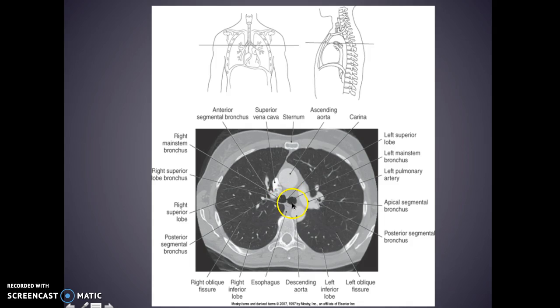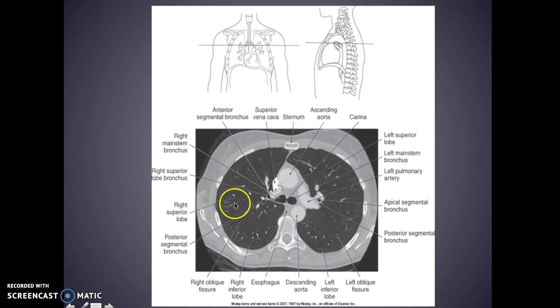This is your left pulmonary artery and we have your descending thoracic aorta. Your esophagus is here and collapsed. Here's your right inferior lobe with your right oblique fissure — you can see right there. I want you to know your right superior lobe and your right main stem bronchus with your superior vena cava — it's brighter white than everything else, so that's going to be your landmark to identify the superior vena cava.